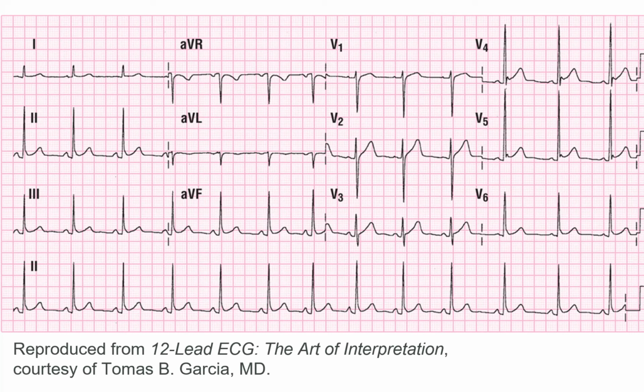We're looking at V1 for width. Yeah. I'll just come right here because these guys are all queued up right here. Right there on the wall. What are we asking? What's the question? The J point on 1. Yeah, this one's good right here. So I'm gonna start 1 little box.